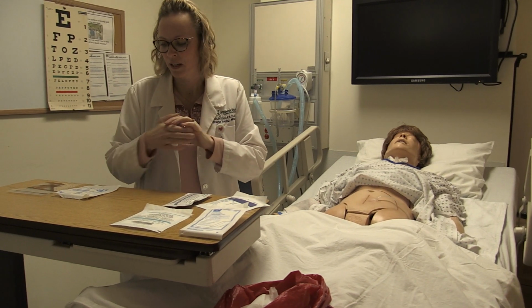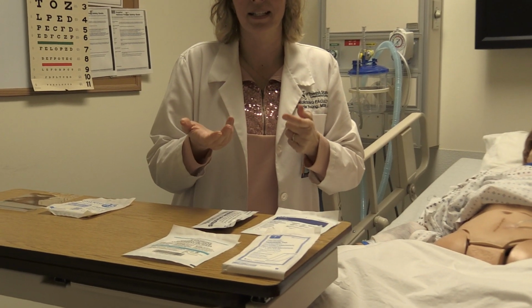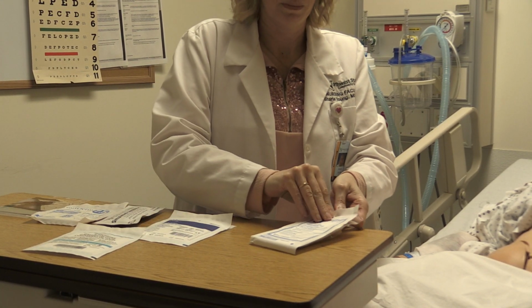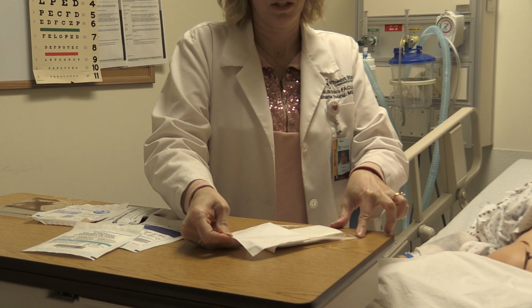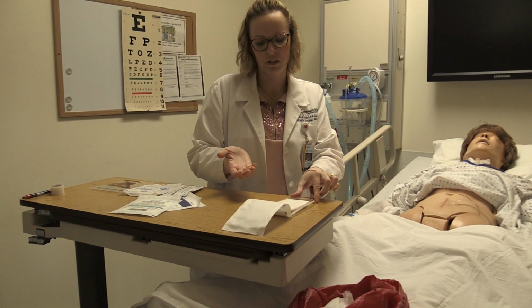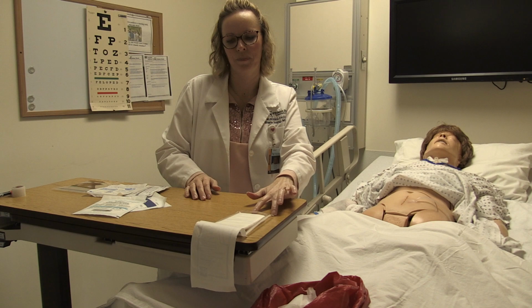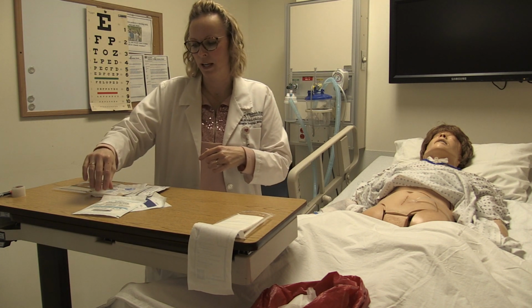sterile field. So the first thing I want to do is open up the package that I will be using last. I will open up that first. So the last dressing to be applied will be the abdominal pad. So let me go ahead and open that up using sterile technique. You want to make sure that you keep that in the package. There's a little plastic tray that you can leave it in, and it'll be a safe place for it. So move that away from you so that you don't cross over when you're gathering your other supplies.